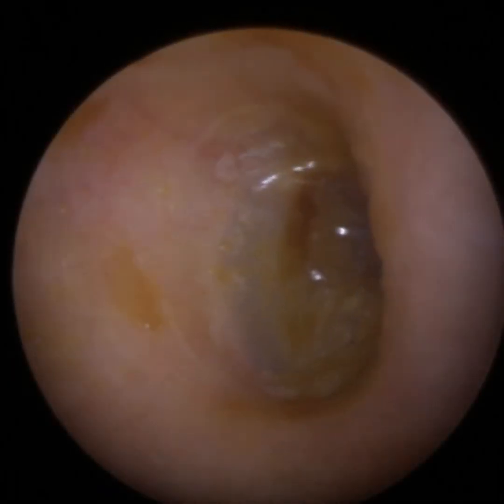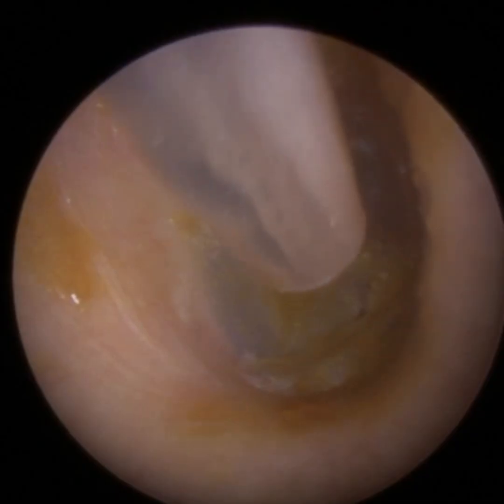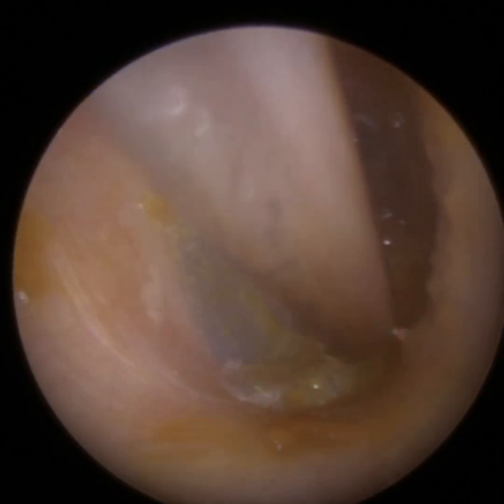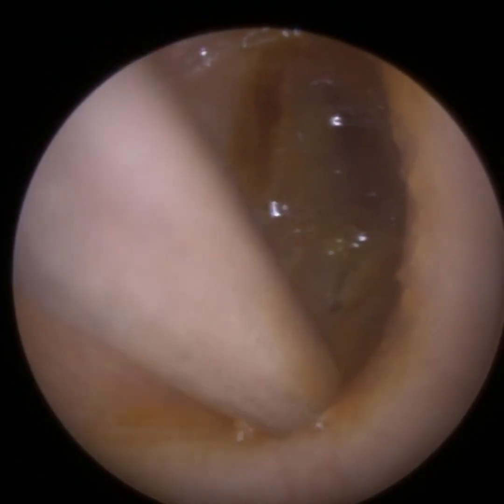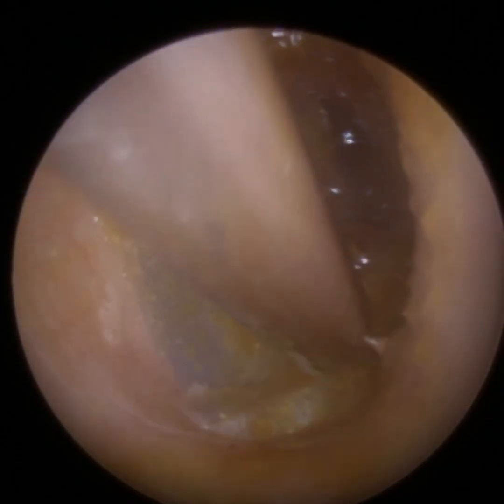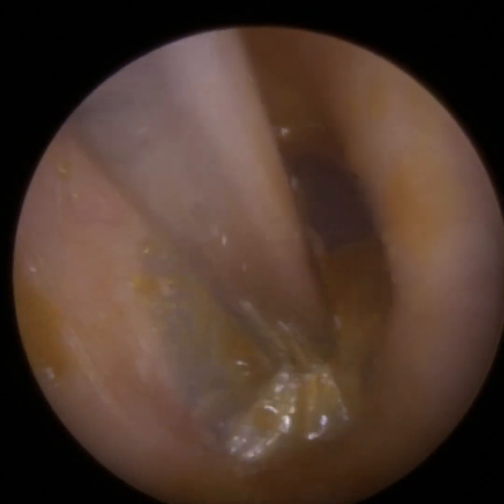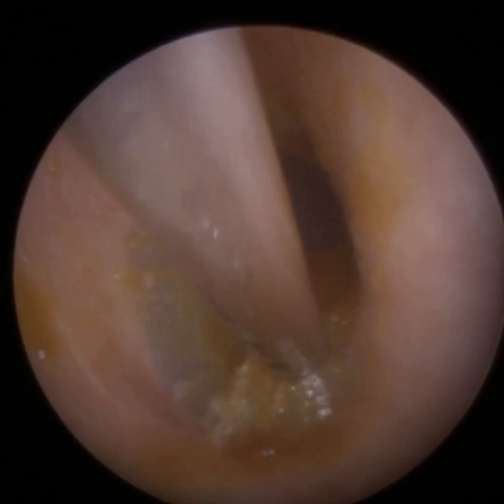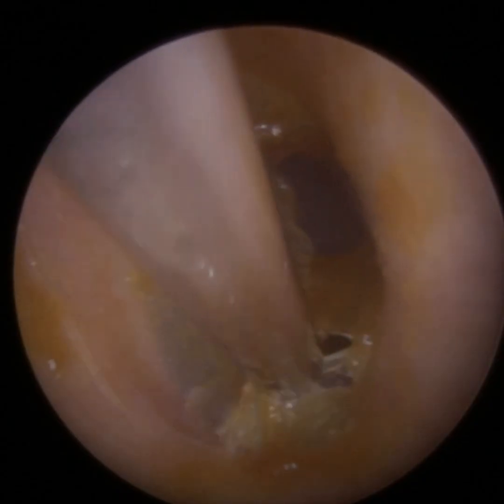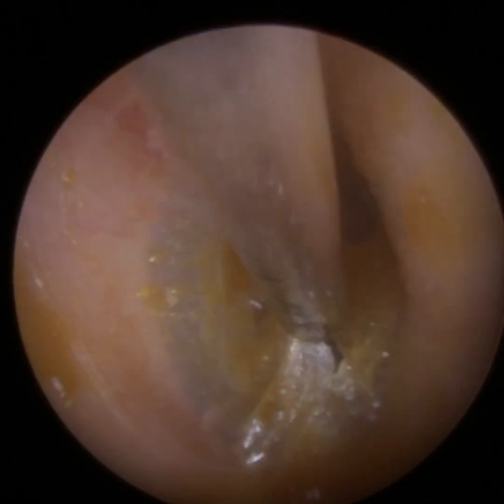So immediately what I did, I instilled some sodium bicarbonate drops into the patient's ear because this skin is really hard and crusted. And I'm now using a fine end suction probe, and I've just suctioned out some of this excess sodium bicarbonate drops. Now, I use sodium bicarbonate drops for dead skin as opposed to olive oil. If you've been watching my videos, I'm a big fan of using some olive oil spray during procedures if you've got wet, sticky, lumpy, mushy wax because it binds it together. However, for dead skin, sodium bicarbonate is far more effective.